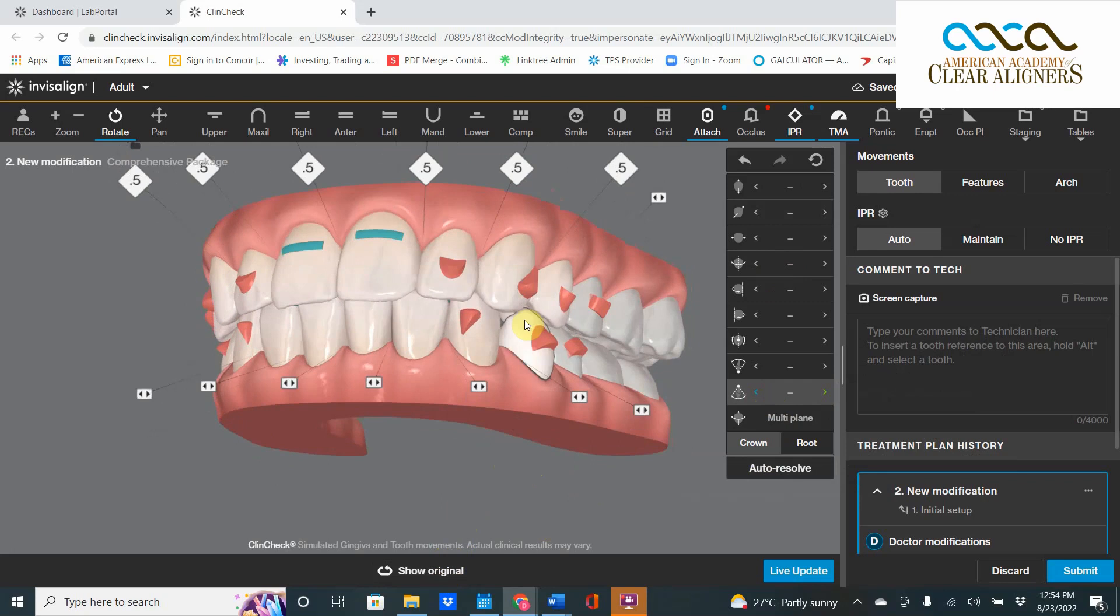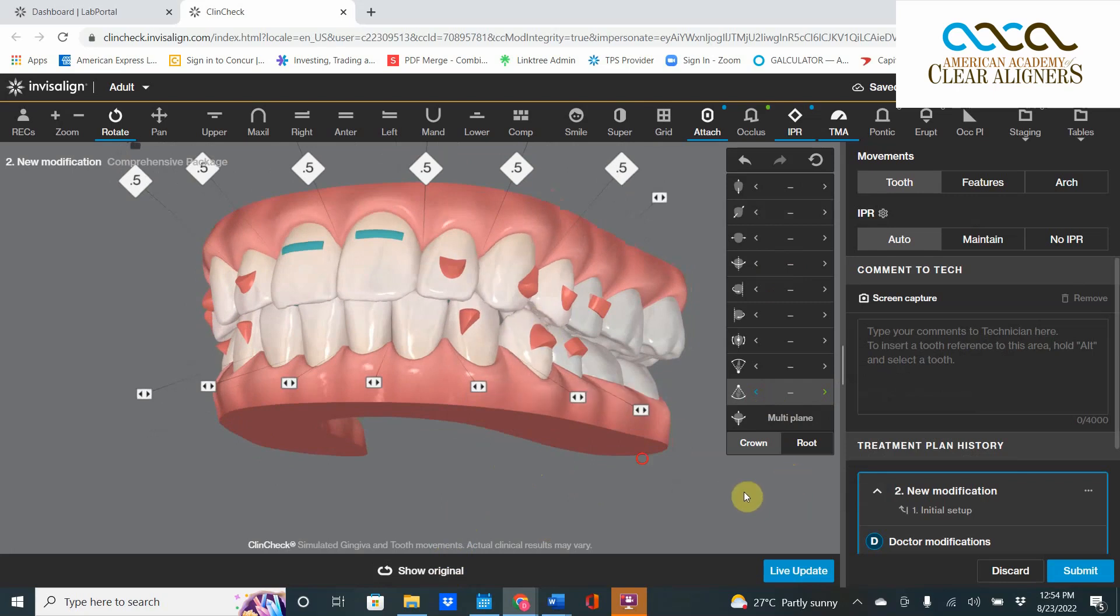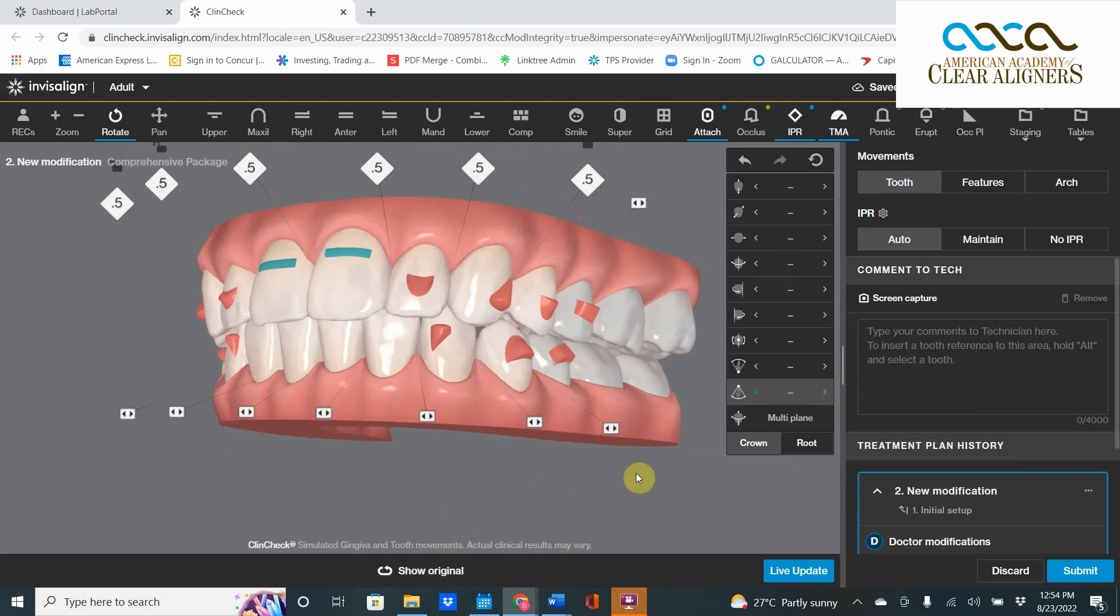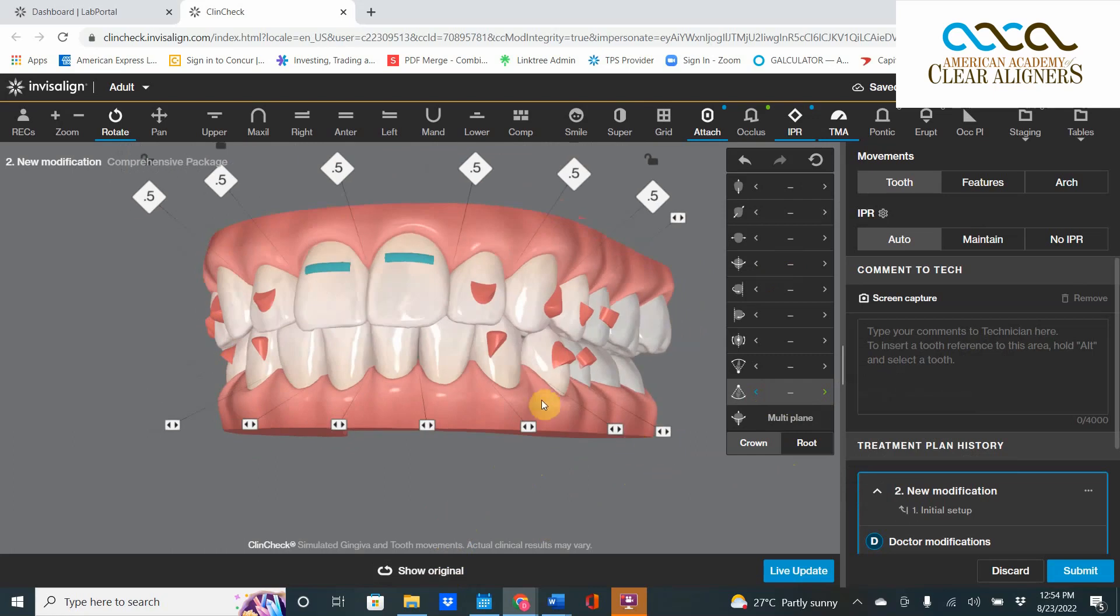Got to remember, you're going to pick up a little bit of interference because these guys don't fit perfectly well. And I hit that button called Auto Resolve, and that just makes sure that my end-stage occlusion is real nice and good. So the end-stage occlusion from Invisalign was here, I brought it out to there.